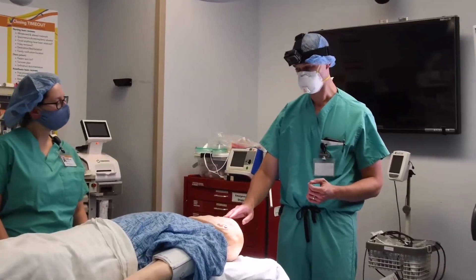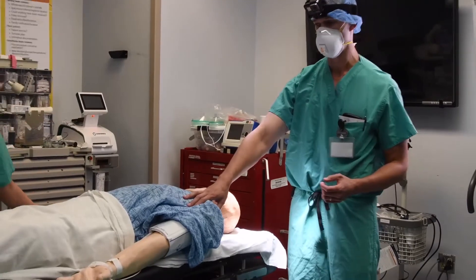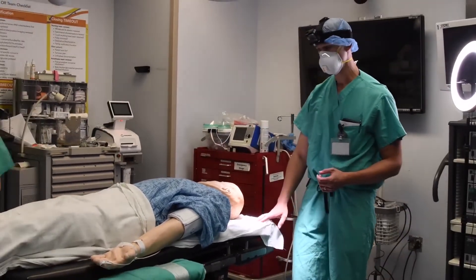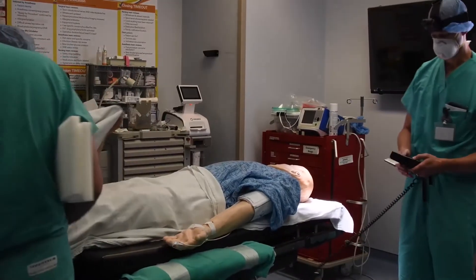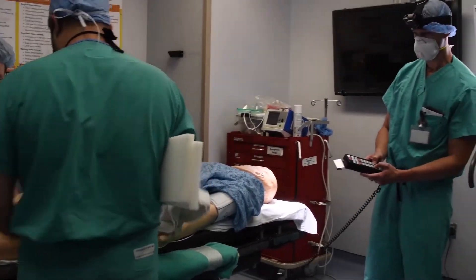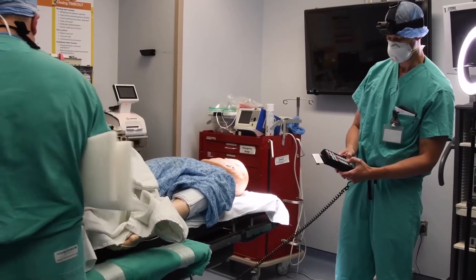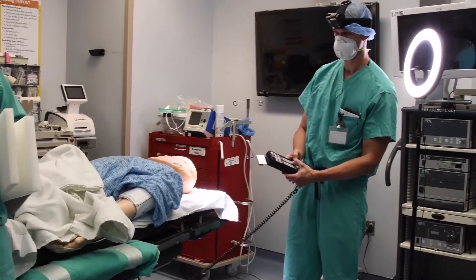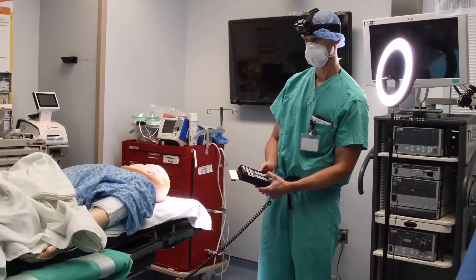We're going to start by positioning the patient on the bed, making sure all the bony prominences are padded. We'll put a pillow under the knees. It also helps to get the patient in what we call a beach chair position — back up and knees down — which is more comfortable for both the patient and the surgeon. Make sure you put foam underneath the ankles as well.